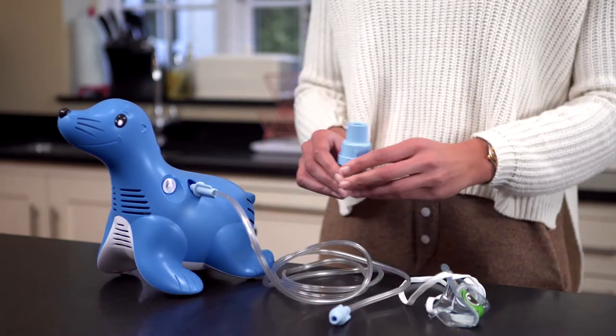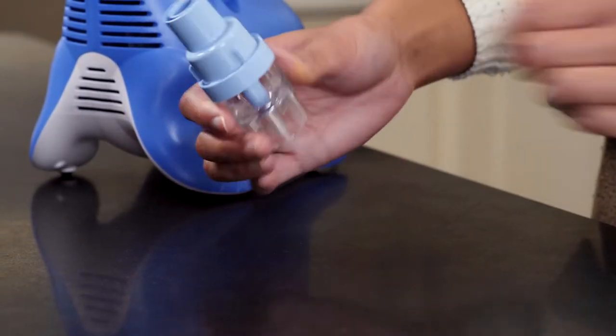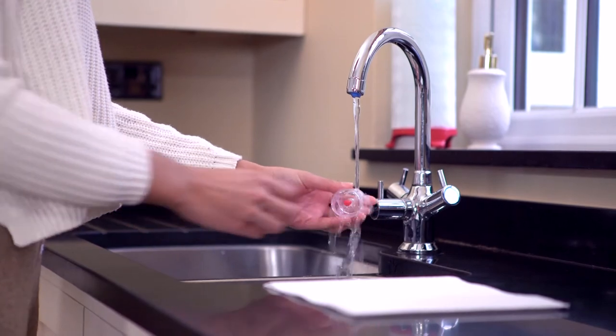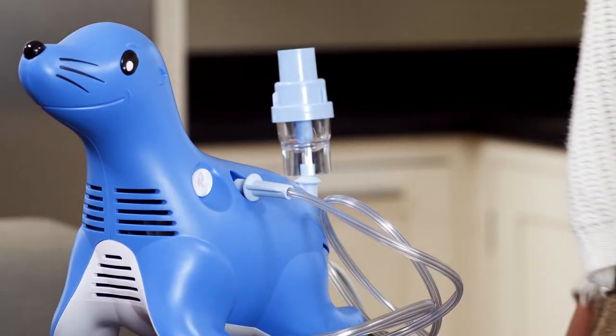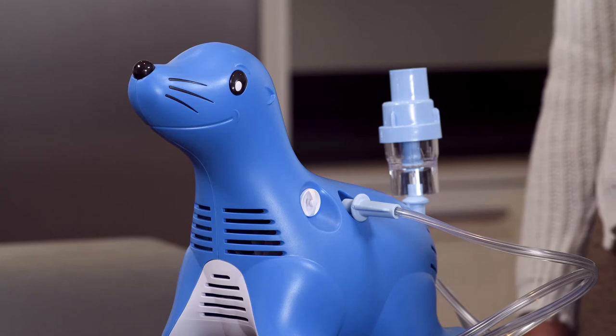Disconnect the Sidestream from the tubing. Unscrew the top from the medicine cup, rinse out the nebulizer, and refill with clean water. Reassemble the top and medicine cup. Reconnect the tubing and run the Sidestream again for a few seconds to flush out any drug trapped in the nebulizer jets.